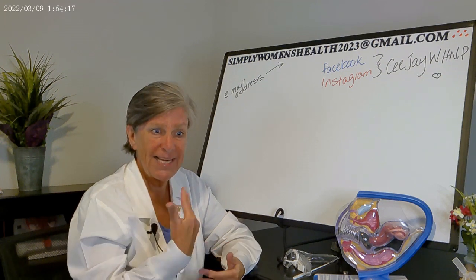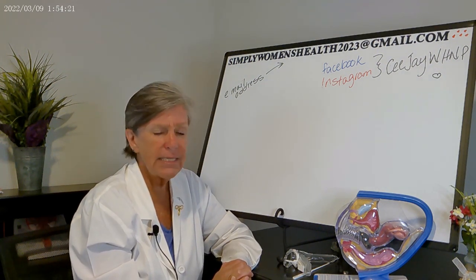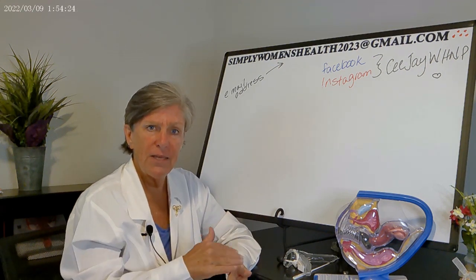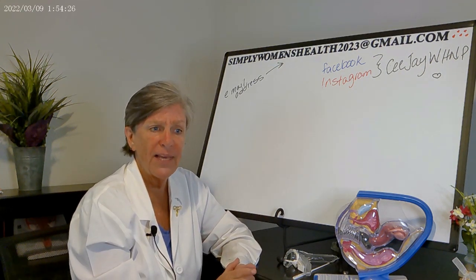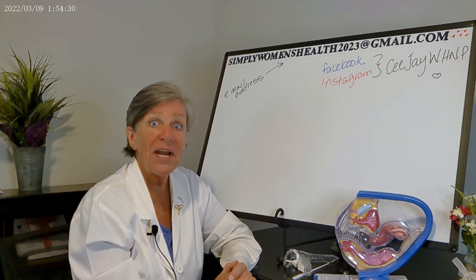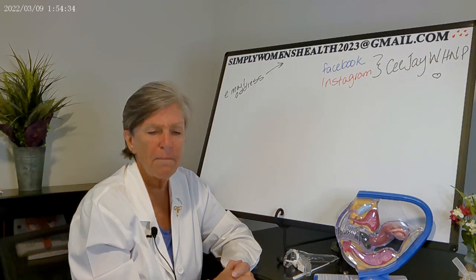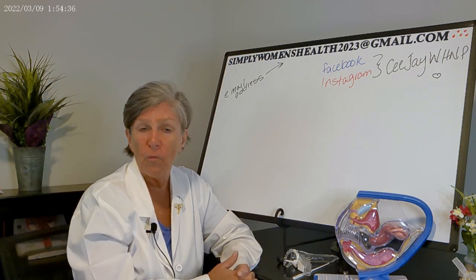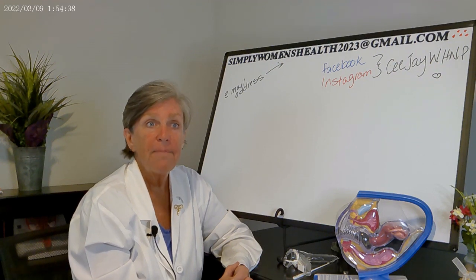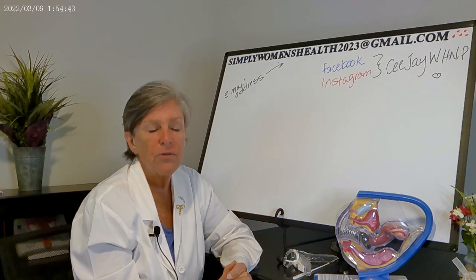2% of women will spontaneously expel or push out their devices, and if that happens, it is not an emergency, but it is something that you do need to have evaluated. They can do an ultrasound to make sure that IUD is where it should be. If you are running a fever, if you have foul-smelling vaginal discharge, severe pain not managed by ibuprofen or a pain reliever of your choice, if you are bleeding heavy enough to saturate a pad, you do need to contact your provider.